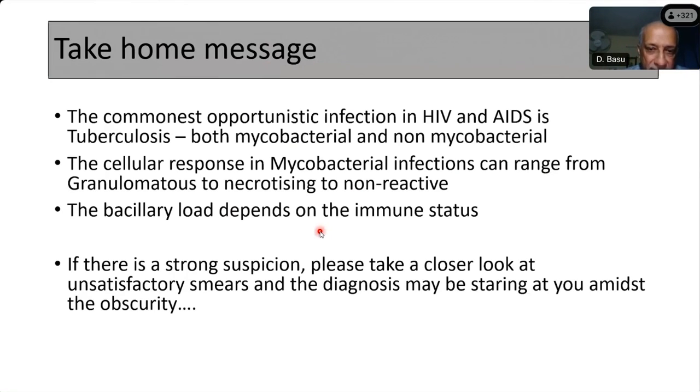Yes, sir. Another question is, how does Fite stain help to differentiate between lepra bacilli and other mycobacteria? The usual way Fite stain is used is for picking up leprosy because it's less acid fast. I mean, the percentage of acid is less. Also, leprosy in the marrow is very uncommon, but it can happen, especially in the lepromatous phase. But you know the basic difference between Fite and ZN stain is the percentage of acid. Less acid.